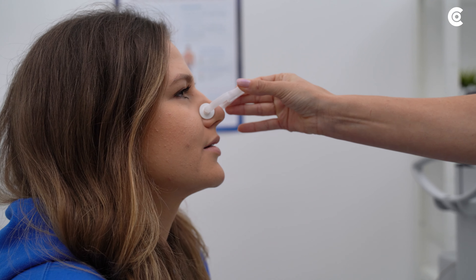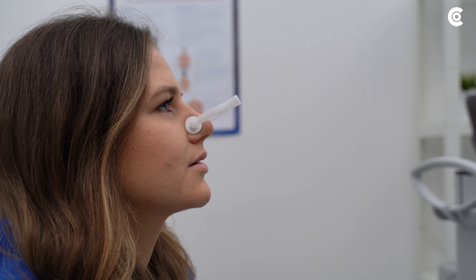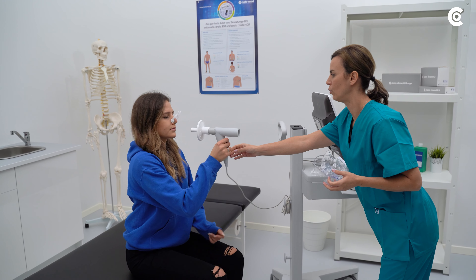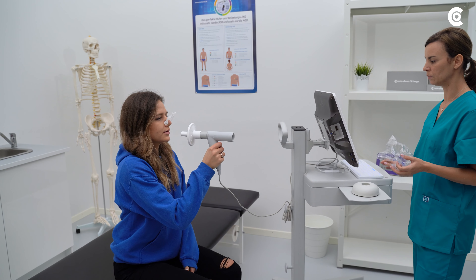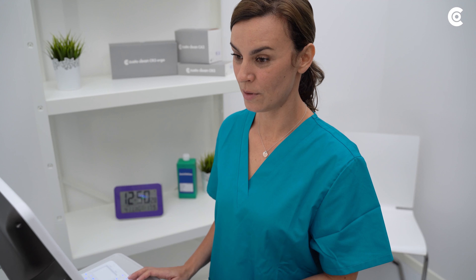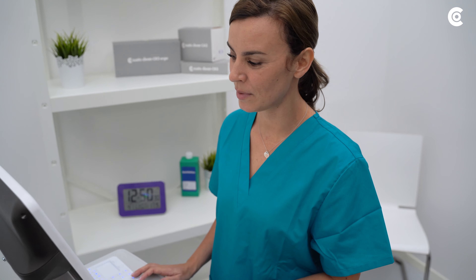Verify that you can no longer breathe through your nose after placing the clip, and hold the Spiro mobile horizontally in front of you. Put the measuring device's mouthpiece into your mouth and fully enclose it with your lips. It is particularly important that no air can escape at the sides.